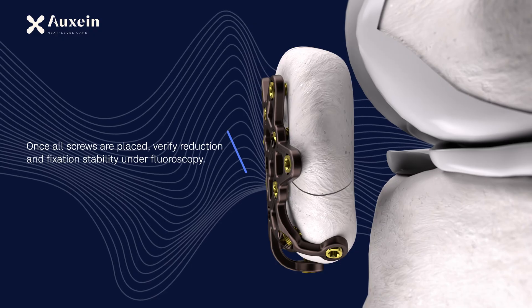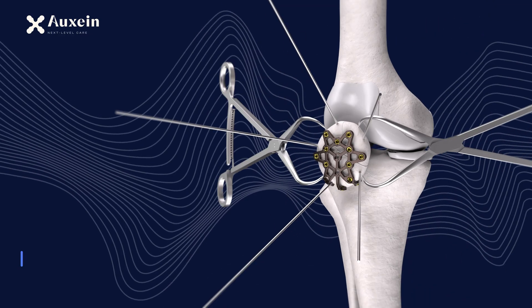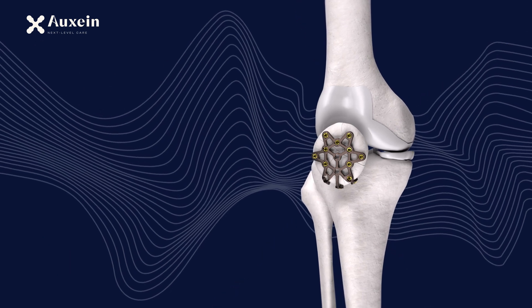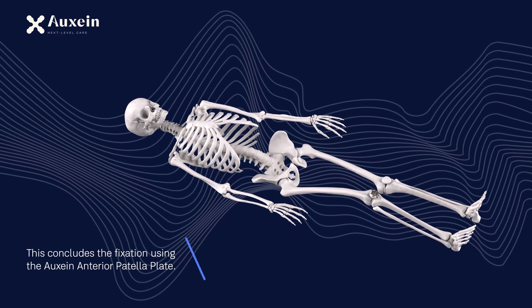Insert additional 2.7 mm AV-Wiselock screws into the pre-drilled holes to stabilize all fracture fragments. Once all screws are placed, verify reduction and fixation stability under fluoroscopy. After the surgery is complete, remove the forceps and K-wires. This concludes the fixation using the Auxein anterior patella plate.